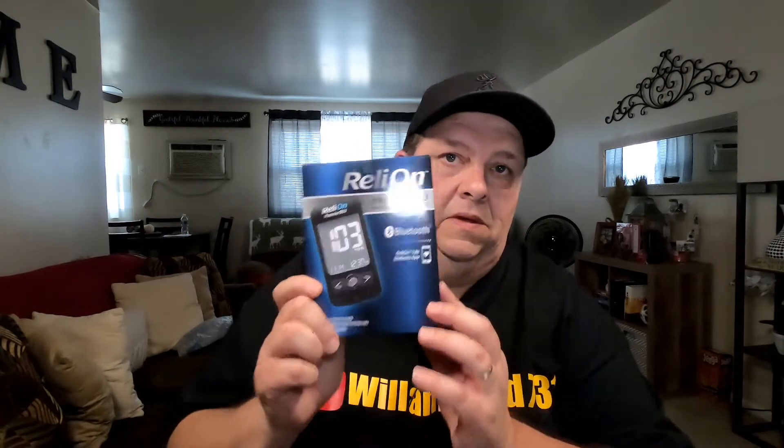Welcome to my product reviews. This is the RelyOn Premier Blue blood glucose monitoring system that I picked up. I actually needed a new one and wanted to try it out. Believe it or not, this only cost me 18 bucks.